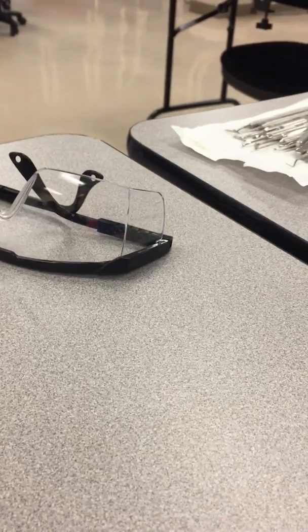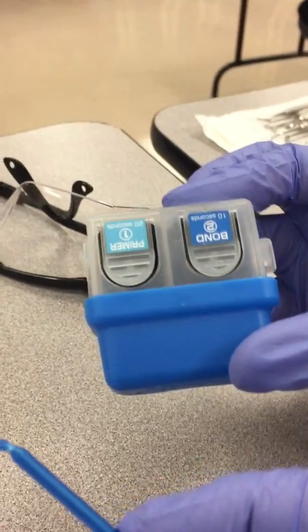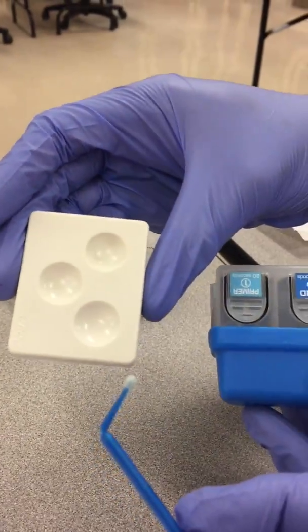Okay, after you've used the primer, you're going to dry the tooth, about 5 seconds. And typically the dentist is going to dry it, but if you do have to dry it, make sure that you express it first. And what I mean by that is take the air water syringe and put it to the side and push the air out first, because sometimes moisture can be in there and you cannot get this wet once we've started, because it'll cause contamination or it can cause the whole thing to fall out.